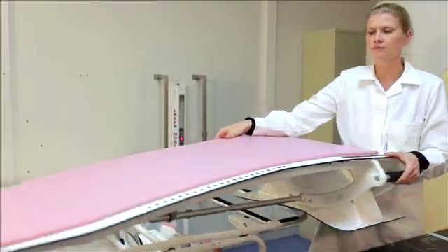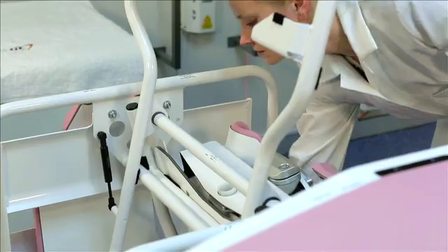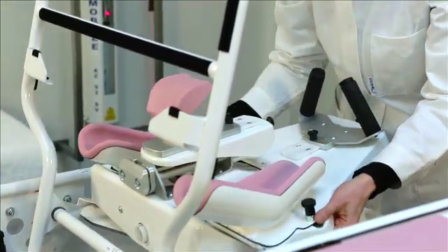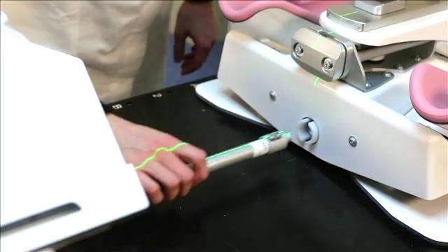Place the caudal part of the Sagittilt on the couch and place it over a two-pin bar. Then place the cranial part on the couch over the second two-pin bar. Connect the cranial and caudal part with the metal shaft.